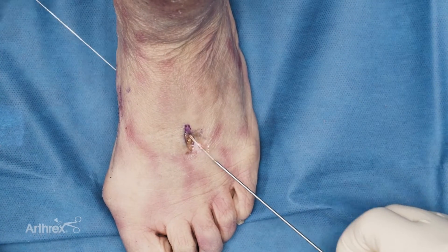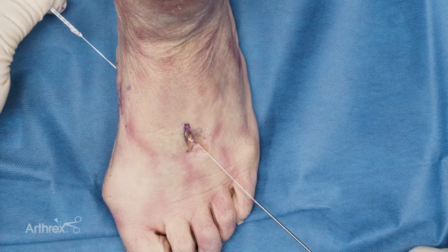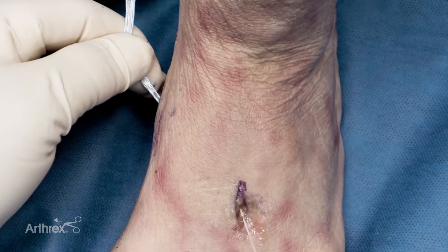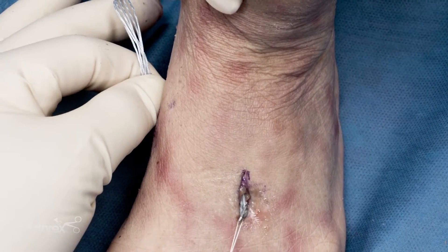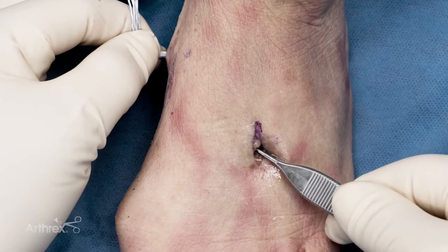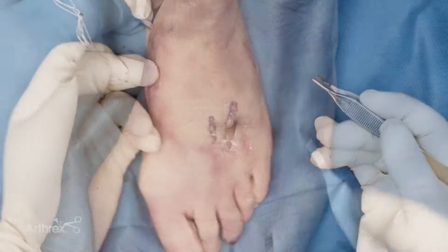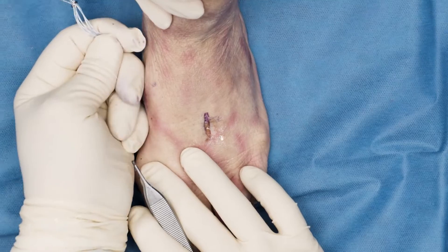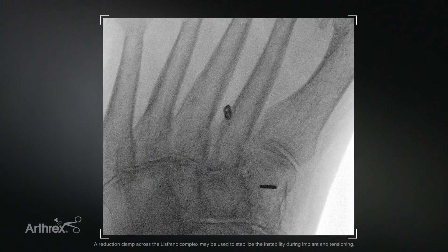As you do this, you want to make sure you watch the button just before it's going to go through. I'm making sure there's tension on it so that it's going to pass quite easily with this technique. I'm going to pass it until it comes out the other side, then make sure I grab the button and visualize it going right down onto the shaft of the second metatarsal. In the beginning if you're not comfortable, you can pull not on the button but on the sutures themselves. With me holding tension on the button, my button is sitting down on the second metatarsal.